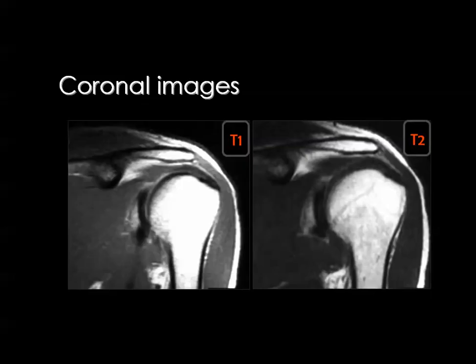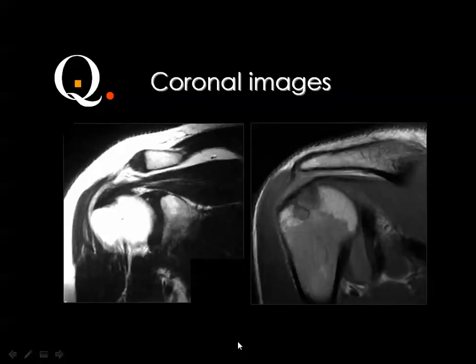Then the supraspinatus tendon is identified by the acromioclavicular joint, while the infraspinatus tendon is identified by the spine of the scapula and this particular protrusion. And here, for both tendons, this is the acromioclavicular joint, and this is the supraspinatus muscle, and this is the tendon inserting into the greater tuberosity.